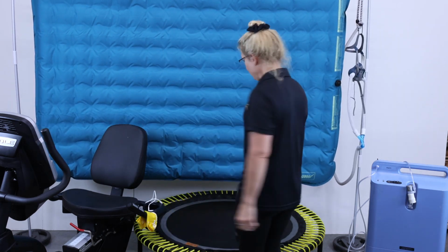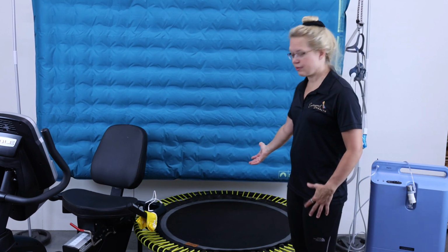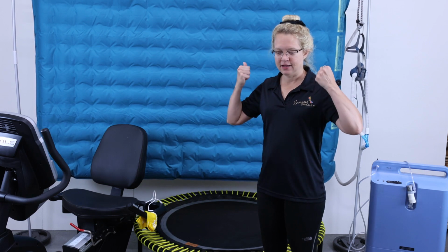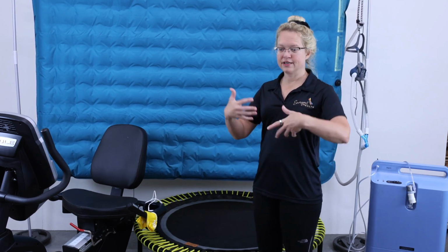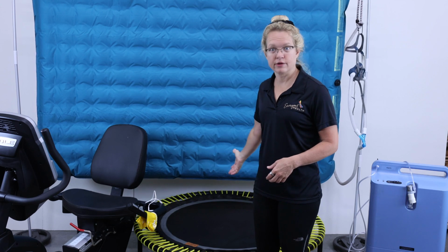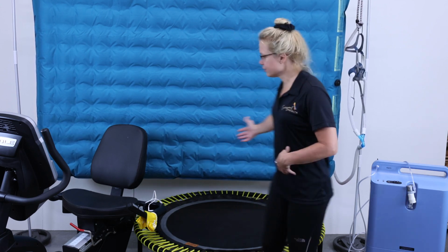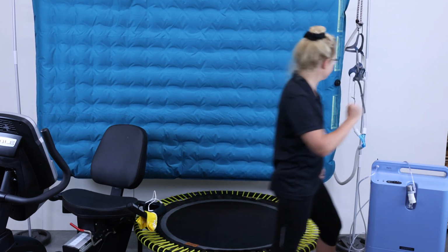So you can use almost anything to exercise. My favorite is rebounding because it's been shown through studies to be extremely effective at creating a cardiovascular effect quickly. So if you're only going to exercise and breathe concentrated oxygen for 10 to 15 minutes, this is a really great way to go, especially if you're an athlete. But the difficulty with doing rebounding is that the hoses want to fall out. So let me show you the mask.